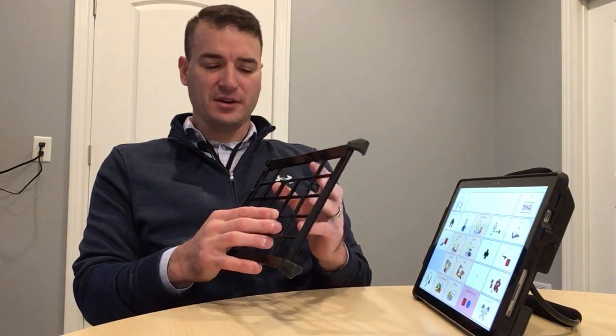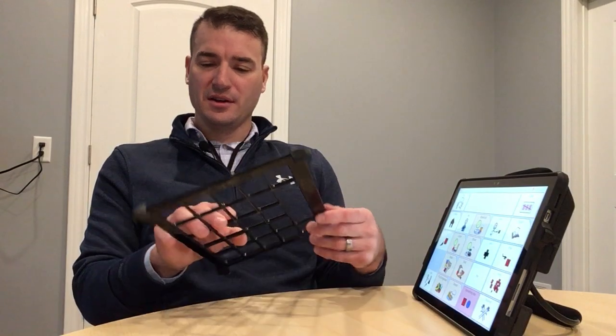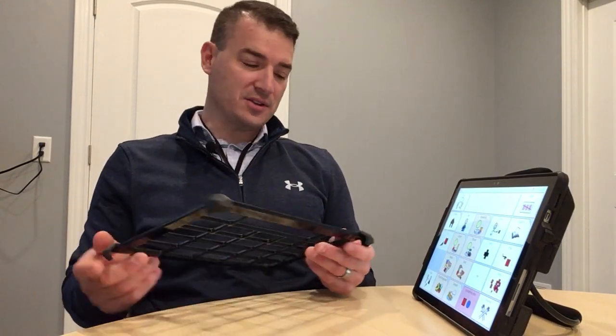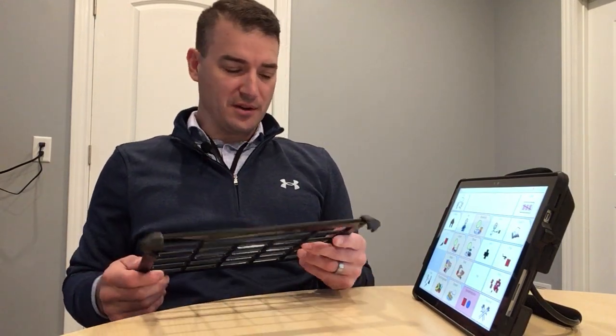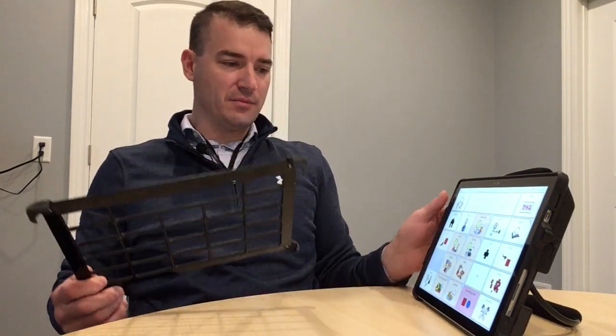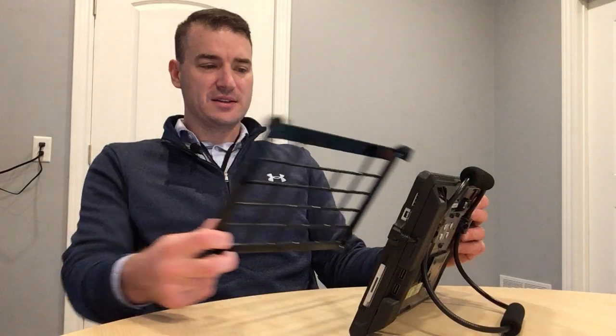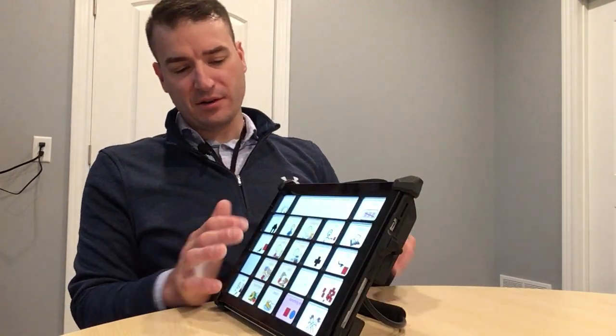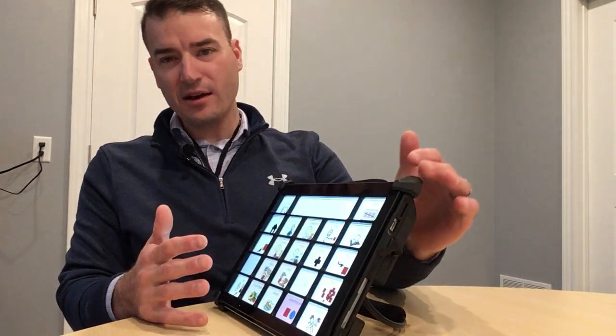So this is our newest key guard, and I did another video on key guards you can check out on our YouTube channel. I can attach this key guard by simply bringing it up to the device, and it clicks onto the face, and you can see it mirrors the layout.